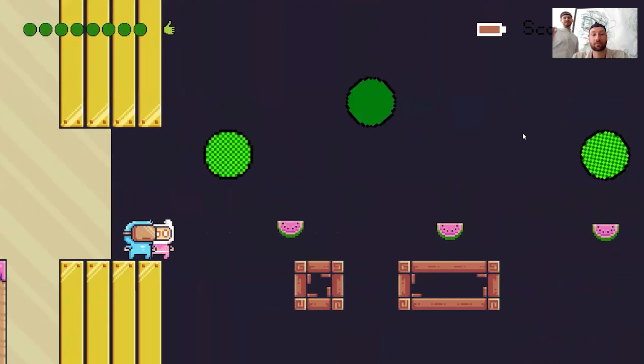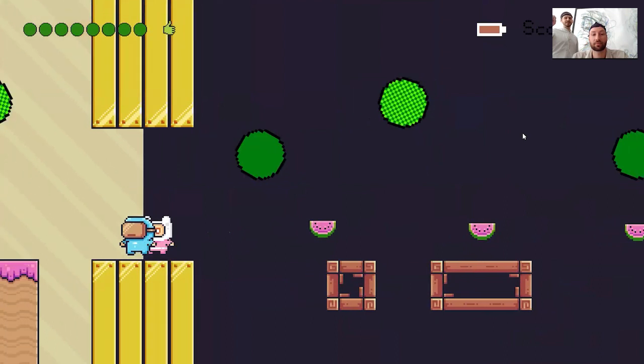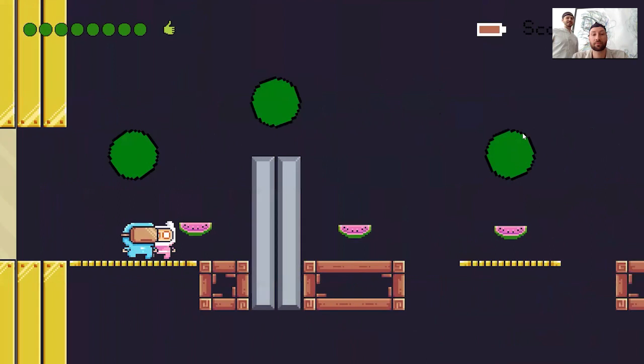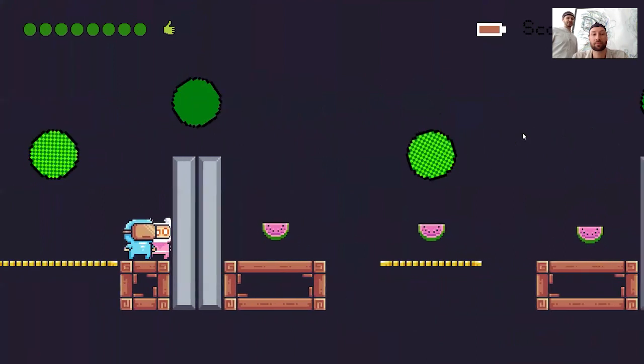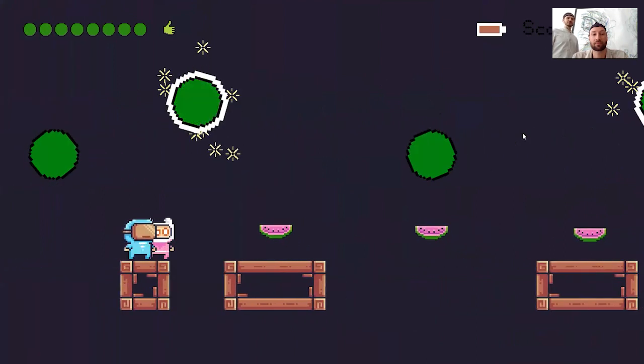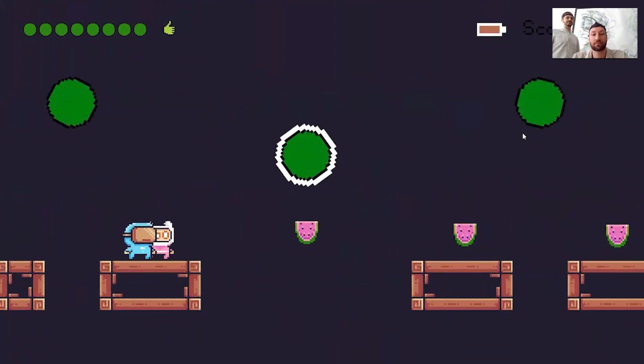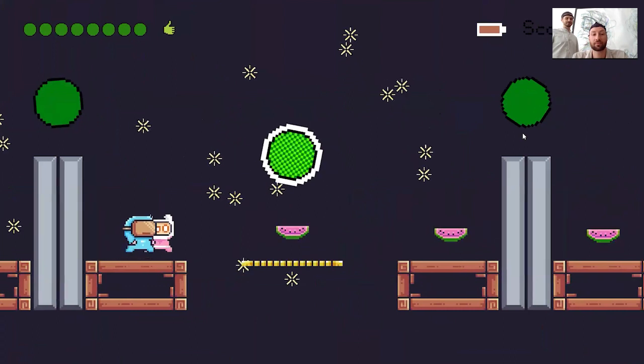So you can always see when we are able to detect that he's focusing on something, then the white circle appears. And when we select it, then these blinky animations come out. And that's what you can do, for instance, with a BCI within a game if you're using the event-related potentials.